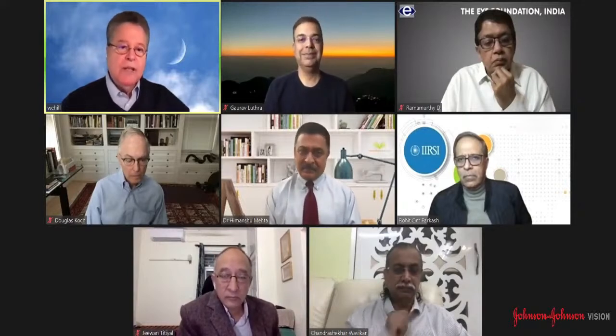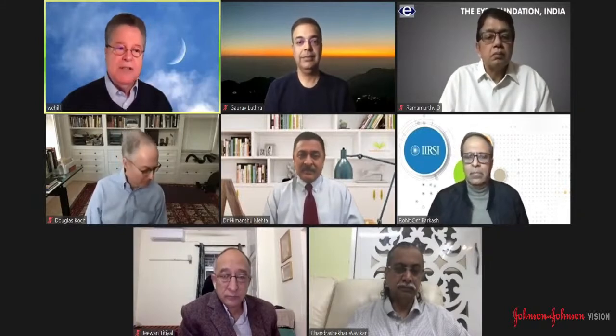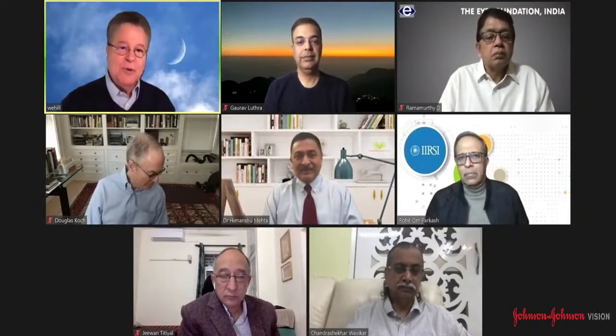They like SRK/T for some reason. That seems to perform well. It's a favorite amongst the Chinese ophthalmologists. And maybe it's just because they're using something that's older and they're familiar with it, or maybe it's because they like it. But the universal feedback that we get is that our formulas that come from European databases are not really all that good for the Chinese eye.